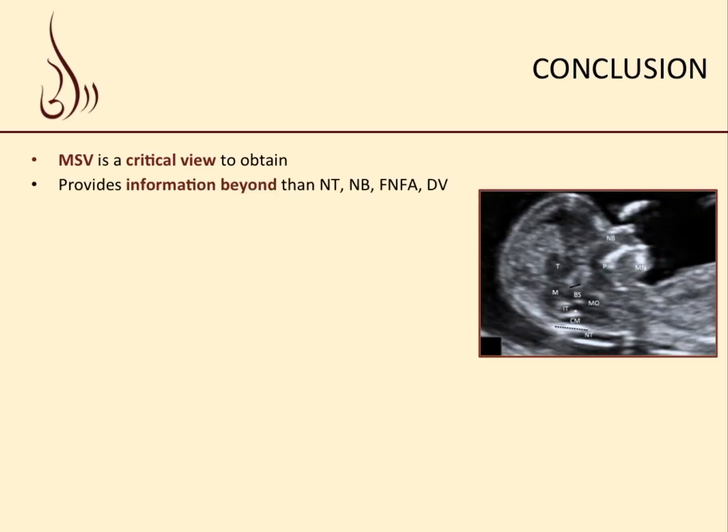It provides information way beyond the NT, the nasal bone, the facial angle, and the ductus venosus.